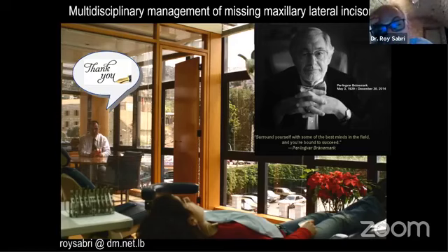If you have a gummy smile and a big canine eminence, yes, sometimes it's hard to get perfect torque to hide the canine eminence. But the way I put torque, I usually use TMA wires because they have a lot of elasticity. They don't give a lot of force.